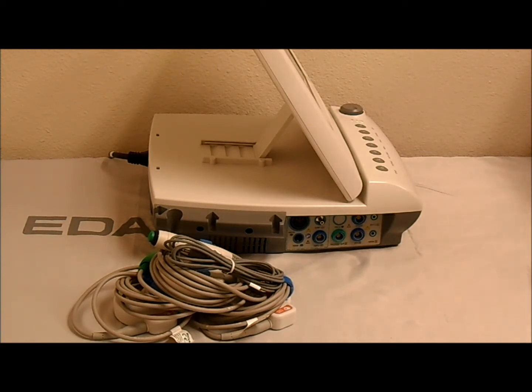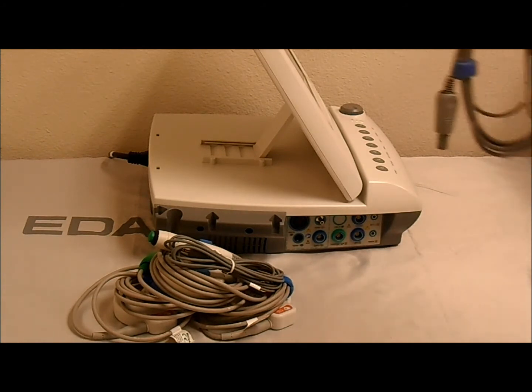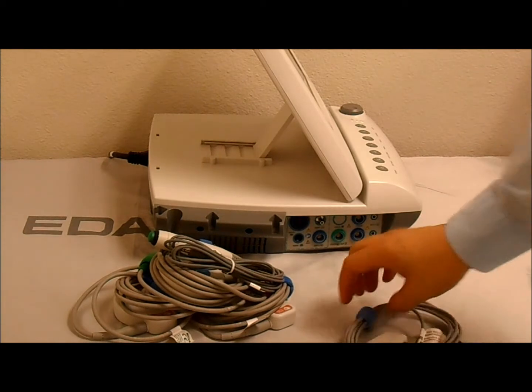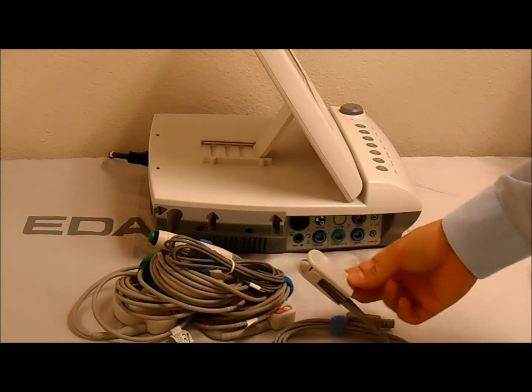Next, we'll go through the monitoring parameters such as your EKG, SpO2, and so on. If your monitor does not have these accessories, it's because your monitor is not equipped for them. That's an optional feature. First, we start with the SpO2 sensor. This connects on the SpO2 port, and you place it on the fingertip of your patient.